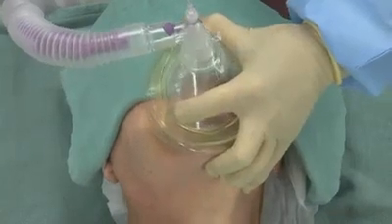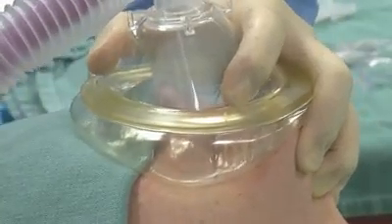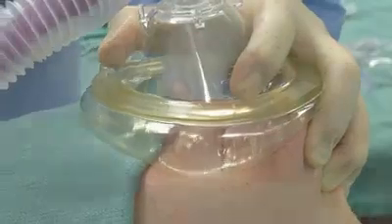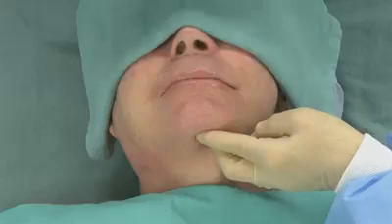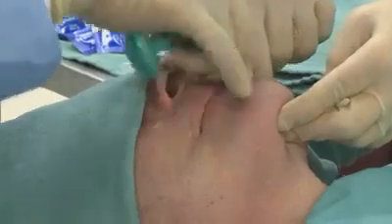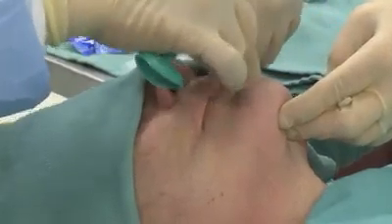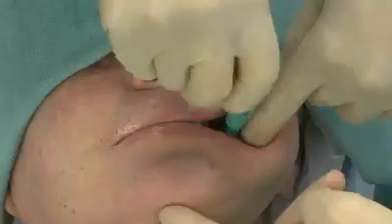In this patient, the procedure is performed after induction of general anesthesia. Ventilation is adequate by bag and mask. An assistant closes the mouth completely to prevent motion of the mandible. A well-lubricated nasopharyngeal airway is inserted to assess the size and orientation of the path. This will also help to create a memory path for insertion of the fibroscope.